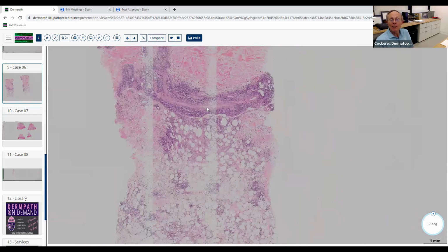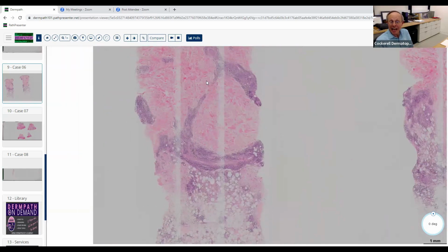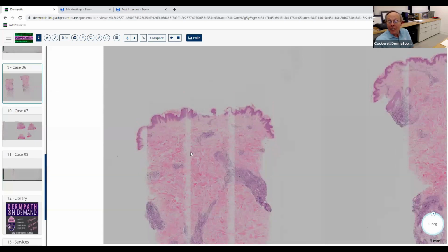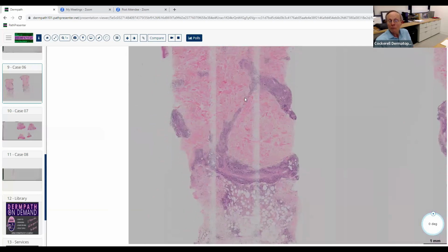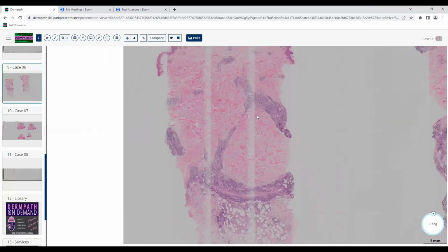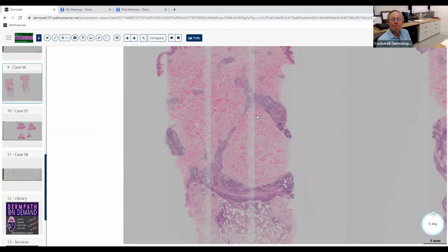Plus up here is the lymphocytic infiltrate overlying that. So if we didn't have this, this would be tumid LE probably, right? That's one of the L's. Lupus is one. What are some others? PMLE, light, lupus, light. What else? Lymphocytoma cutis. Good. What else? Jessner's. Jessner's lymphocytic infiltrate is probably either tumid LE or PMLE. It's probably not really a disease per se.